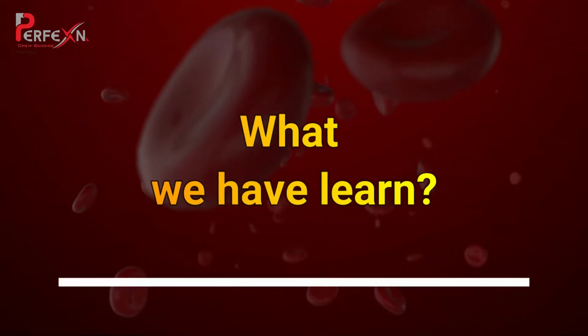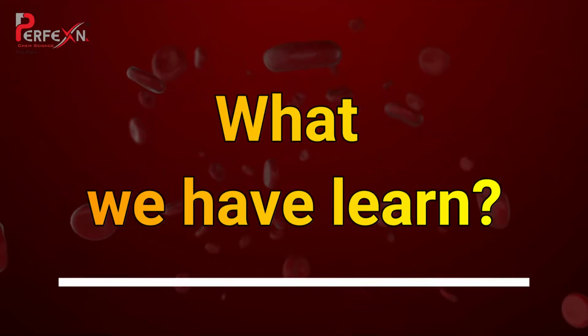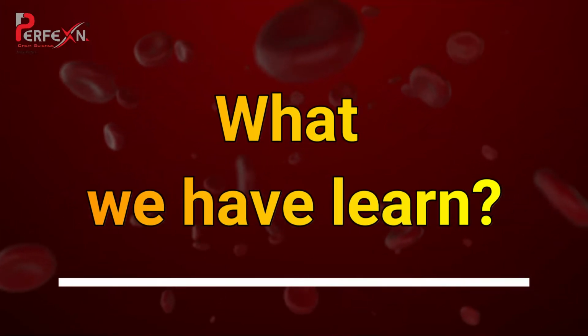So here we have learned about the chloride test, its clinical significance, symptoms, kit settings in the semi-bioanalyzer, and the procedure for chloride, etc.